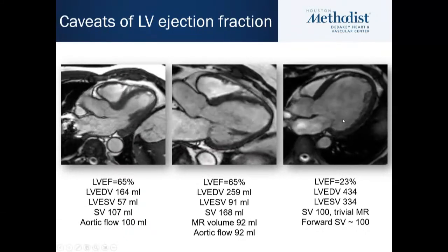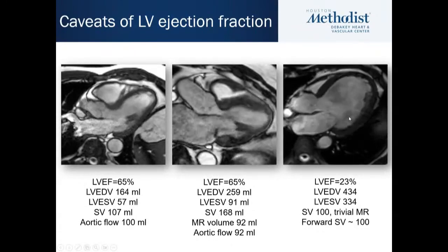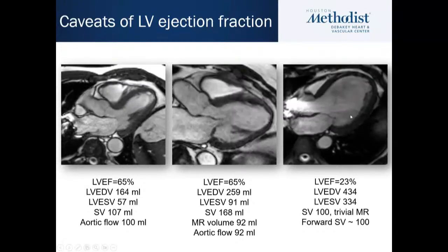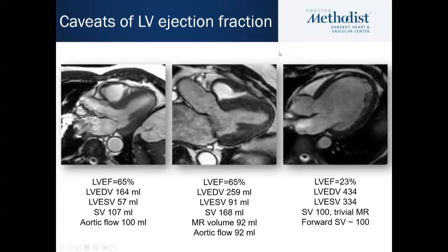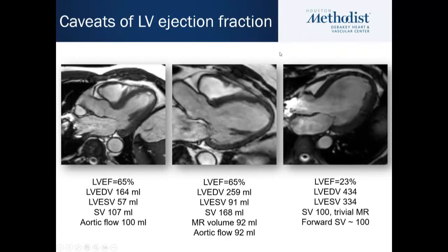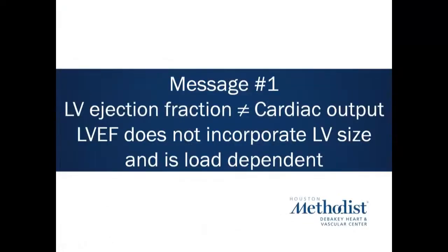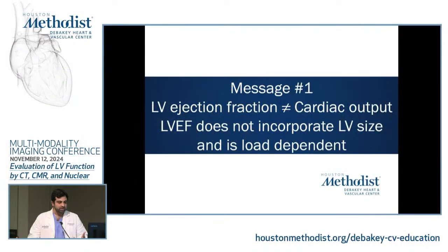Now, that doesn't obviously take into account what happened to this patient with exercise, how their PA pressures are, or how their afterload is. So keep in mind all these aspects, but remember that there's a lot more to the heart's performance than EF. That's the message. So cardiac output and EF don't necessarily correspond. The EF doesn't incorporate the LV size. It is load dependent, which we'll discuss also.